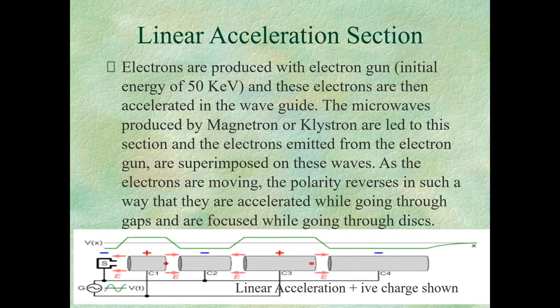So that was the question earlier. And the other answer to this is, if you are treating larger tumors with your FFF beam, then you are trying to treat a large area where your beam is not uniform. So in order to get that uniformity, your accelerator has to use MLCs vigorously to get that area covered. And when it is shielding most of the time and treating for a smaller time, you are going to get thousands of MUs. That is one of the reasons you can get more MUs when treating with FFF.